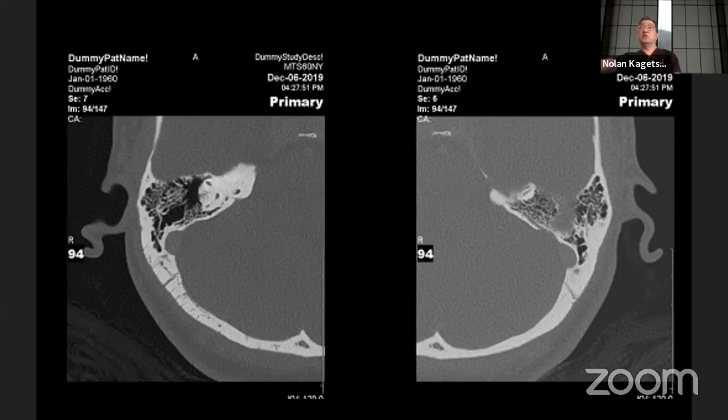This patient has a fistula from the occipital artery to the transverse sinus, which lives roughly about here. And we call that a dural AVM. Just that kind of subtle observation: many people will be just looking at the bone, but you have to be looking at the occipital bone and this asymmetry. And the confirmatory test for this patient would be to do what we call an MRA.